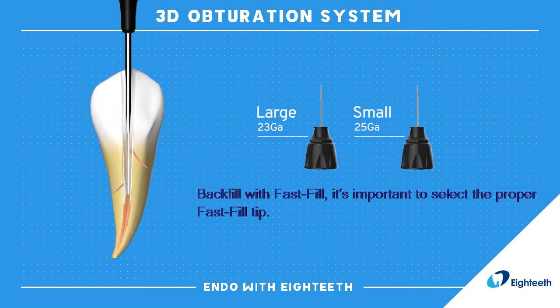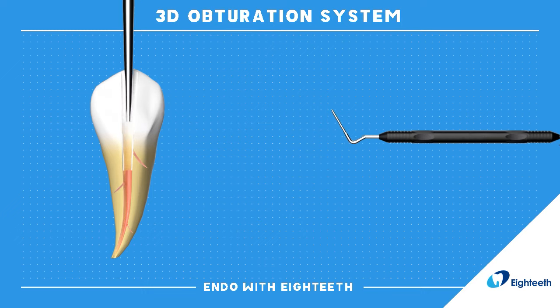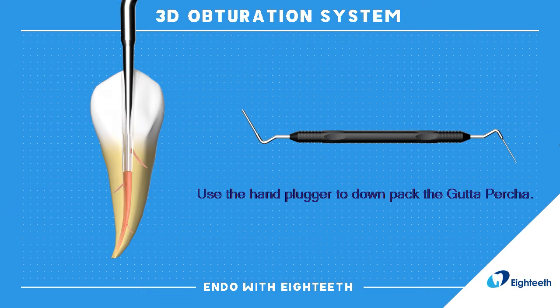Backfill with FastFill. It's important to select the proper FastFill tip. Use the hand plugger to down-pack the gutta percha.